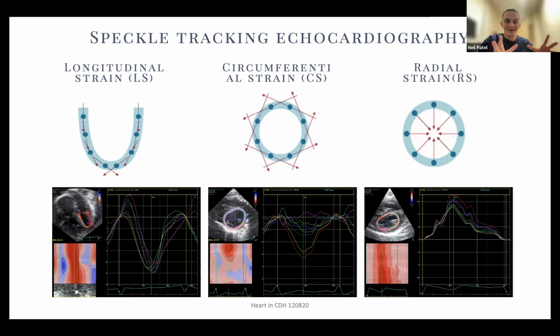So let me show you that in real life, in an echo on a patient, to show you how we actually get those curves. But while I'm doing that, I'll just open up for any thoughts or questions, and anything that needs clarified from what I've said so far. Go for it, guys. I'm just going to switch over and hopefully share this echo with you as well. Any questions, thoughts so far?